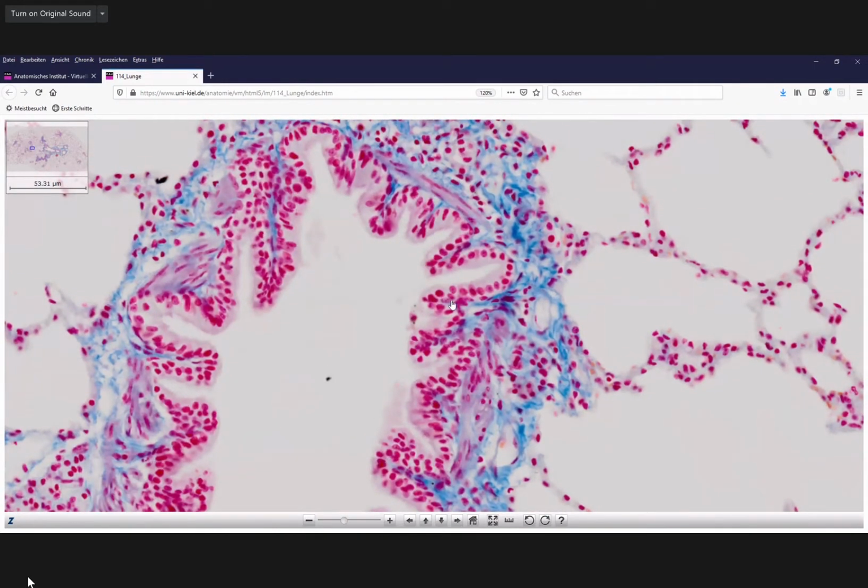And you should have less and less goblet cells, and less and less ciliated cells. There are some, and in the beginning there are probably still a lot, but the farther you go within the bronchiole duct system, the more these cells disappear. But there is a new cell type which appears instead. Who remembers what that cell type was? Club cells? The club cells, exactly.